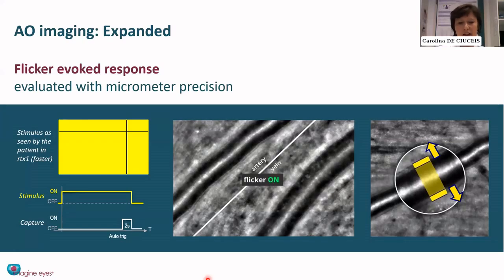And accordingly, flicker light-induced dilation has been observed to be blunted and impaired in patients with untreated hypertension or other cardiovascular risk factors such as dyslipidemia, or in patients with diabetes mellitus. And interestingly, it has also been shown that flicker light has a predictive value in terms of mortality in patients with cardiovascular disease or with chronic kidney disease.